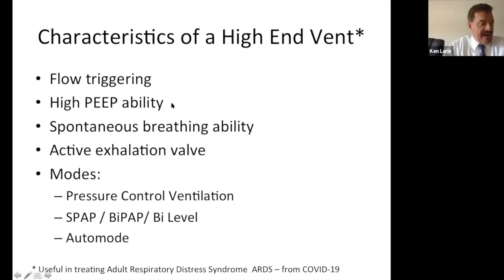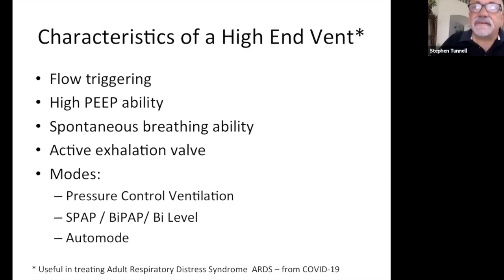Right, it was positive expiratory, what were the other? Yeah, it's positive end expiratory pressure. It's the pressure right before you take your breath in.